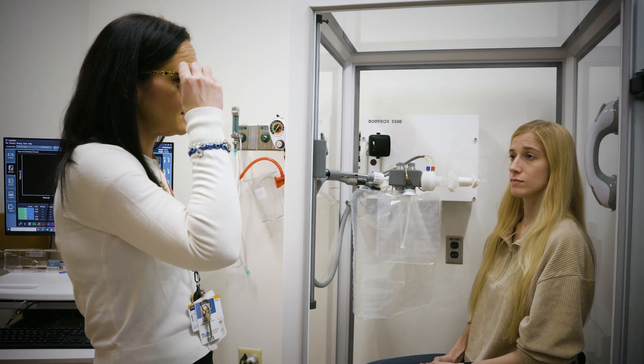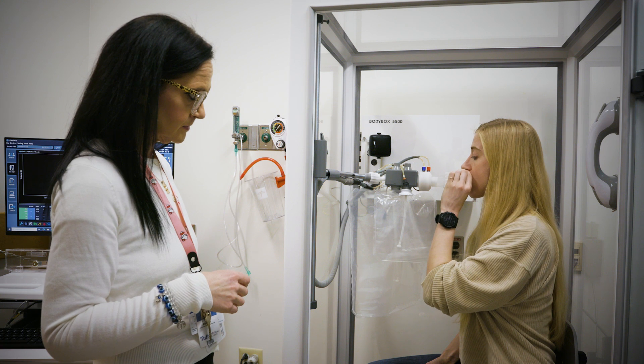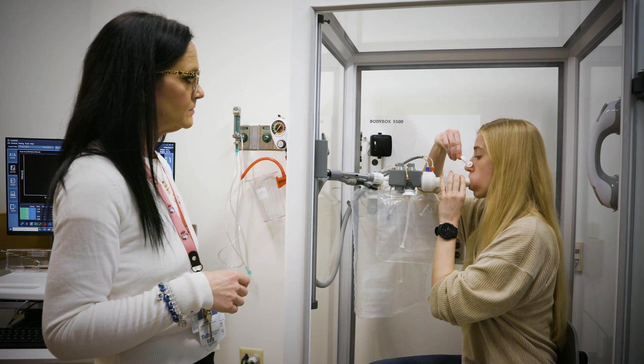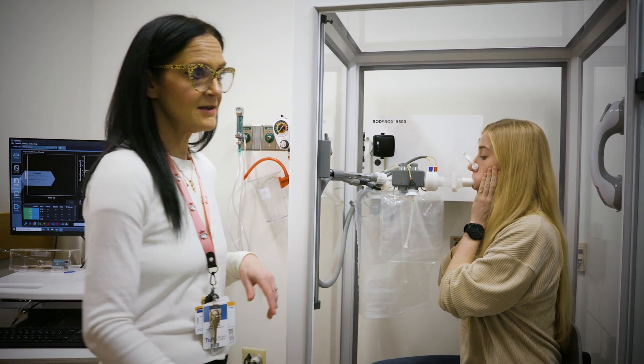This next test is called plethysmography, or a body box test. This test also measures the maximum amount of air in your lungs and how much air is left after slowly breathing out. This test requires that you sit in a glass box. The glass door will need to be closed for this test.